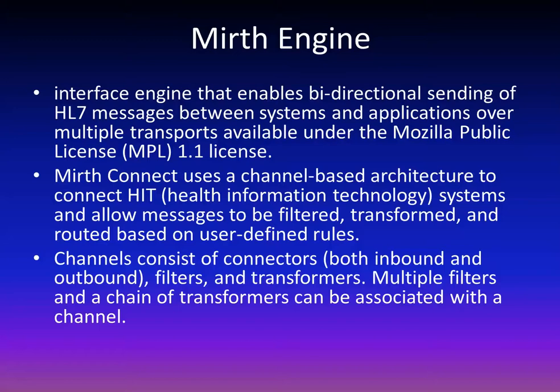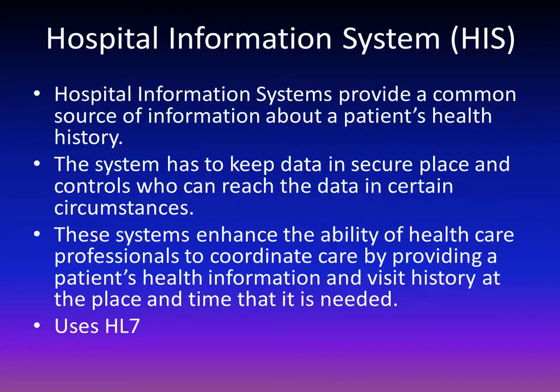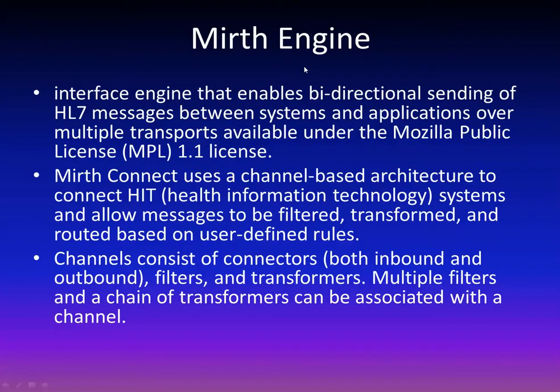And the last slide I have here is talking about the Mirth engine. The reason I put this up is we use a Mirth engine for our product. It's an interface that enables bidirectional sending of HL7 messages between systems and applications over multiple transports. It was developed under the Mozilla Public License. I wrote that here. I don't know that it's really that important.